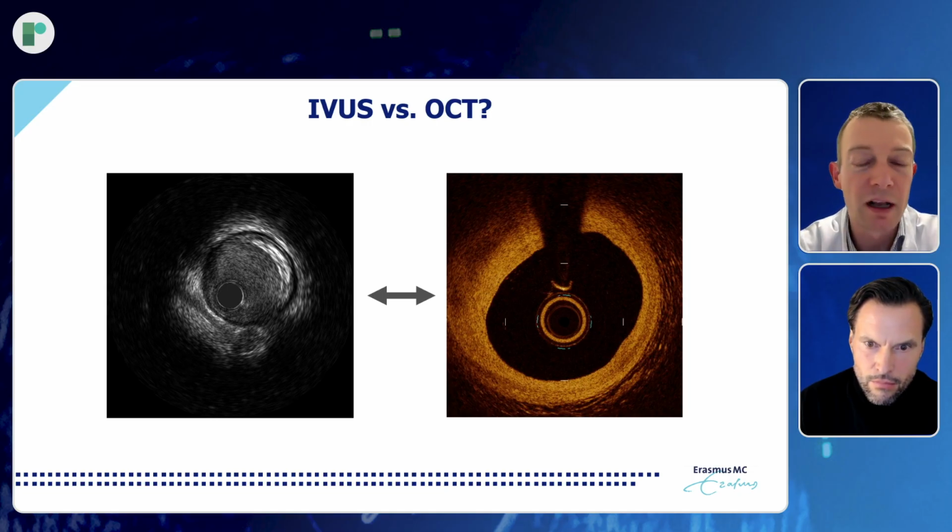Now, with new AI algorithms, that is being facilitated for the operator, but with the current technology available in most cath labs, you mostly see the lumen. For those who are not trained that well in intravascular imaging yet, this may be misleading. In cases in which the lumen is large, for instance 6 square millimeters, the vessel may have a reference lumen area of about 12, meaning there's still a plaque burden of about 50%.